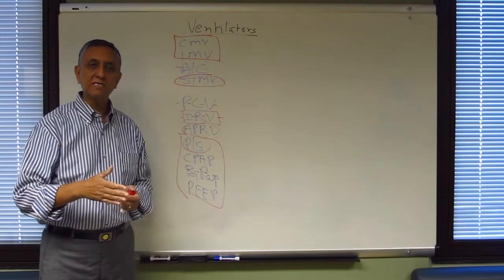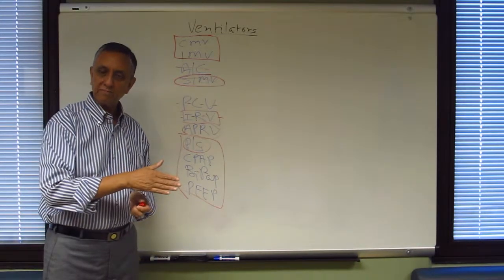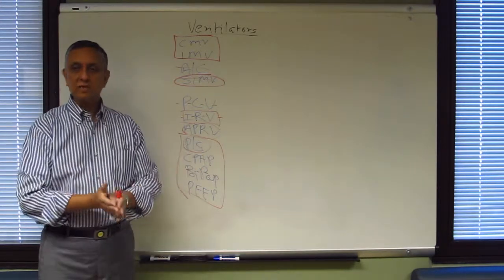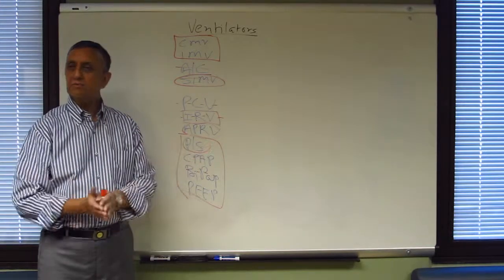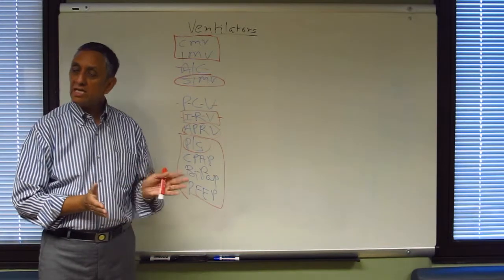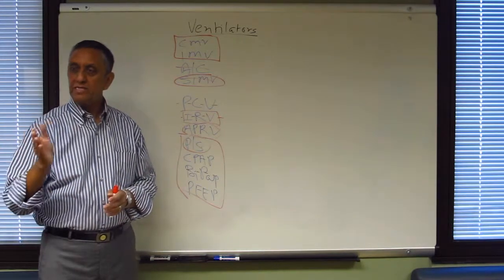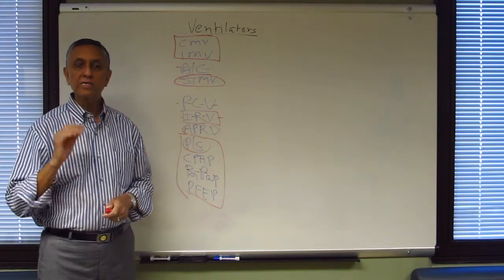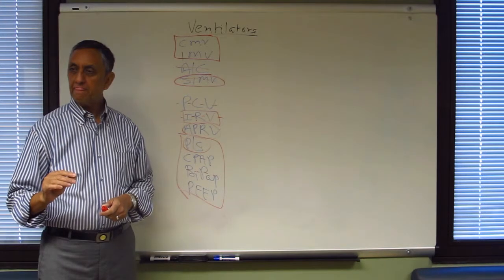That was the challenge with SIMV, that's why pressure support was developed. Now if we go by definition, it's a pressure given during inspiration all the time. So then the tidal volumes again should not be changing, but it sure does change, and I'll explain in a moment. But before that, it's important to know, pressure support is only during spontaneous respiration.